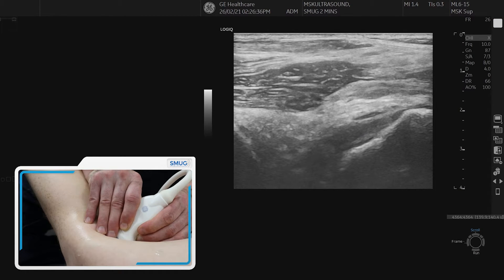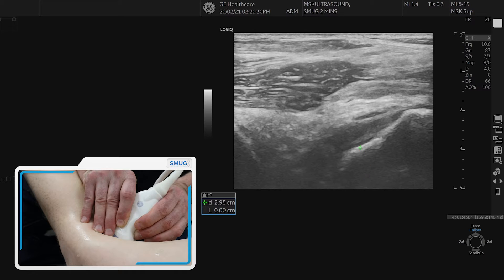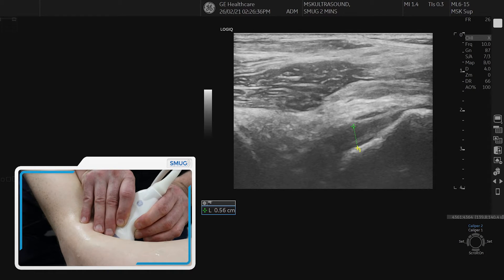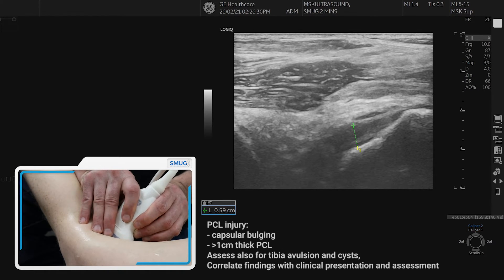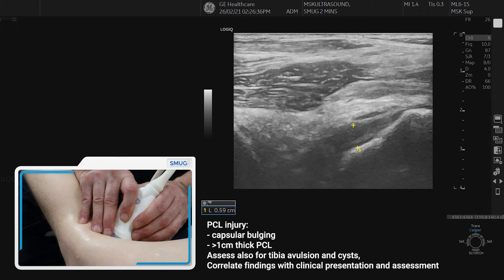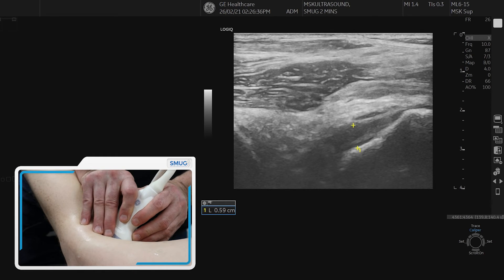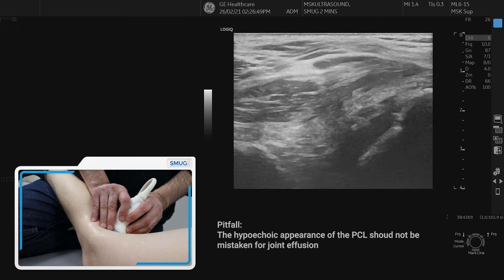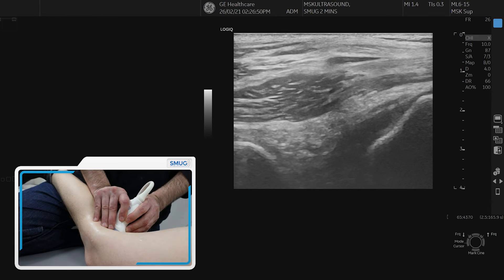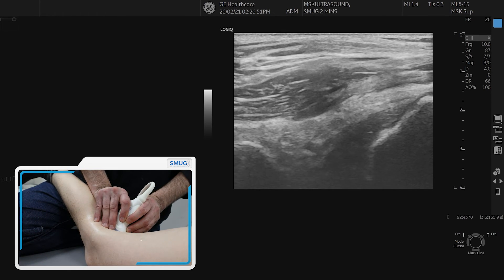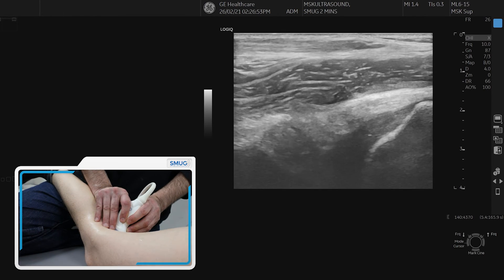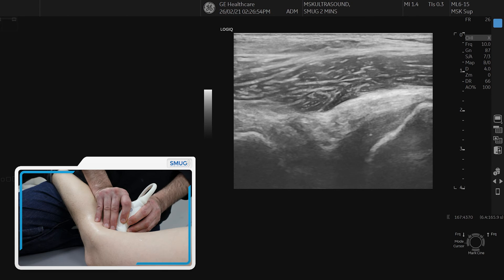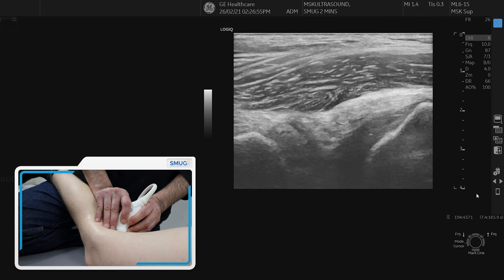If you angle it a little bit more by putting the proximal probe part down, you can start to see some of the fibers of the PCL. If it's injured, it will start getting thicker and push the capsule upwards — your clinical test will also confirm that. Be careful not to confuse this with any effusion in the joint; this dark area is the PCL, not an effusion.